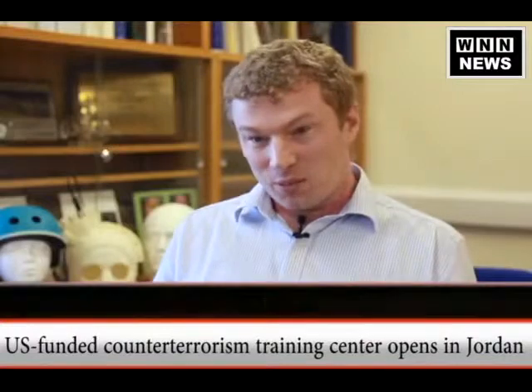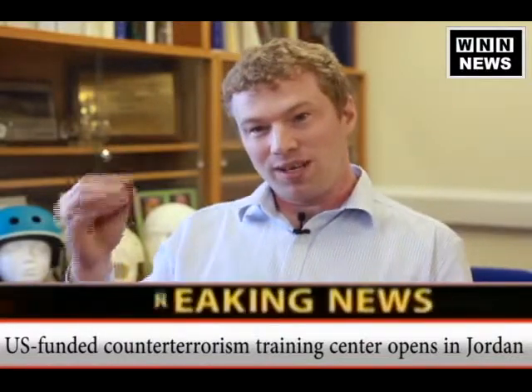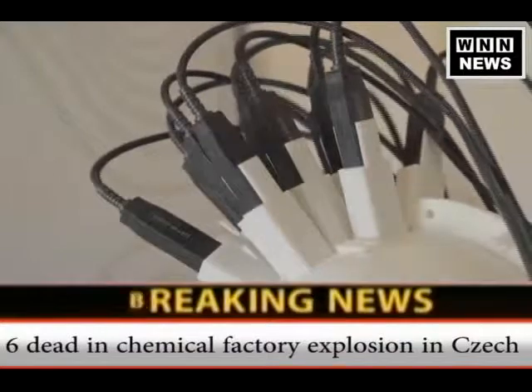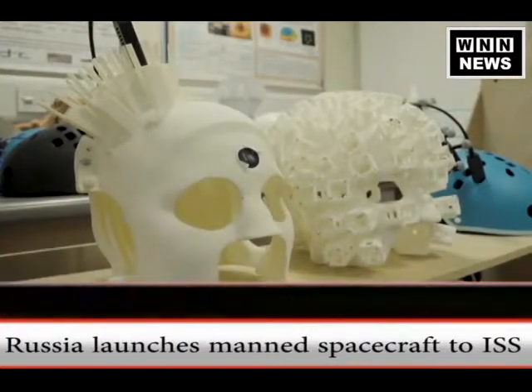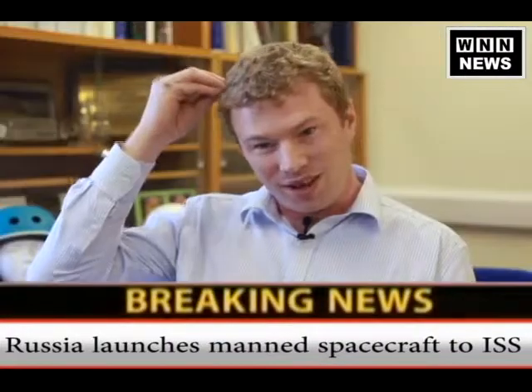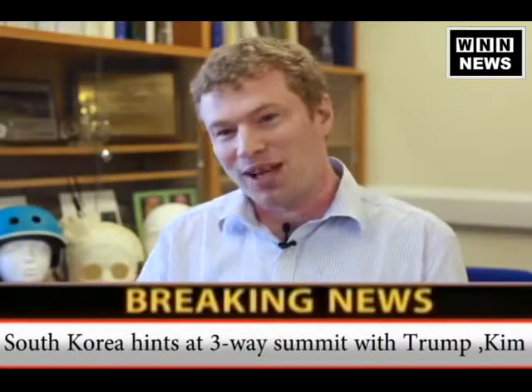So to build a wearable imaging system, you really need two things. You need very, very sensitive magnetic field sensors that are small, lightweight, and that can go on the head, and that's what we had with the quantum sensors. And then you need a way to house them on the head. And so to do that, we built a 3D printed head cast that would house the quantum sensors close to the scalp, and that was designed based on a single subject's head shape.